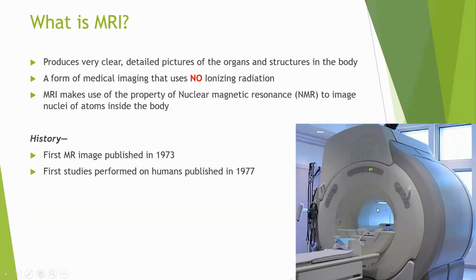The gantry where the patient slides in, lying down in supine position, has also increased. There is a lot of light, and you can also hear music, which is actually very good. Otherwise, you might feel claustrophobic inside the MRI.